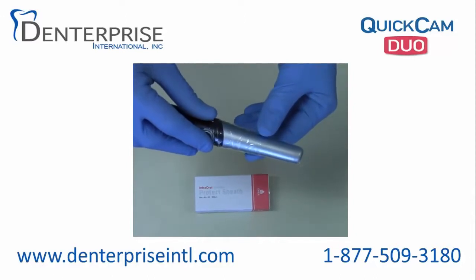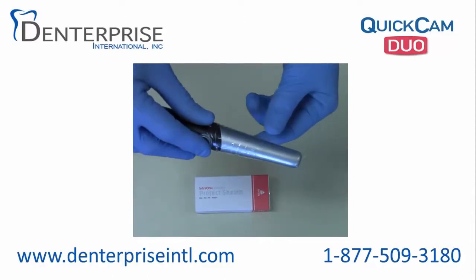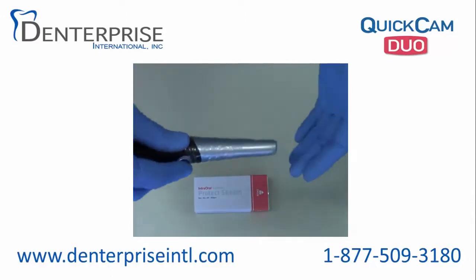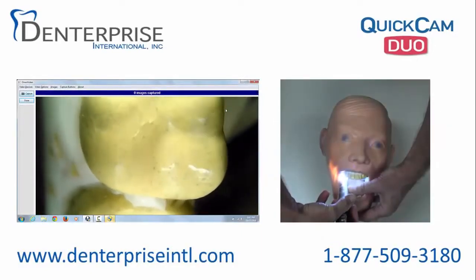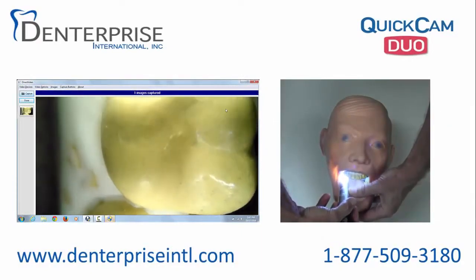Once you are comfortable holding the QuickCam Duo with one finger on focus and another on the capture button, here are some examples of upper jaw photographs. These are taken on our model Fred the Head for simplicity.